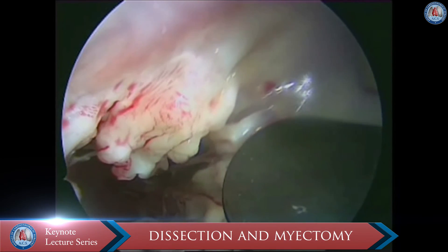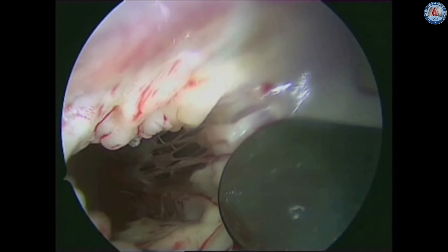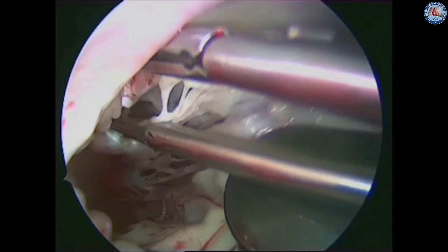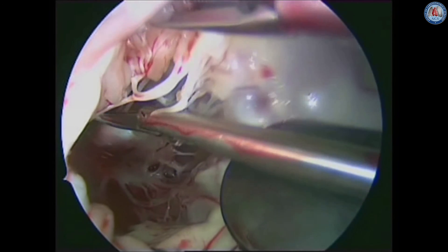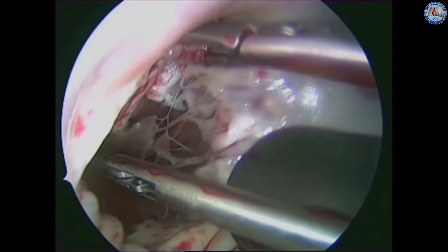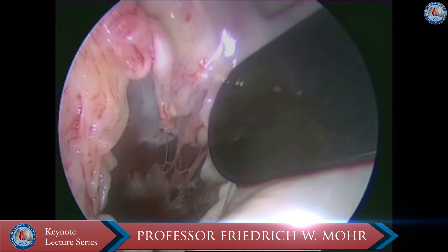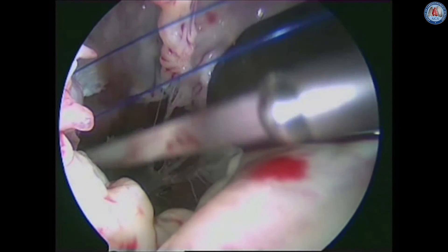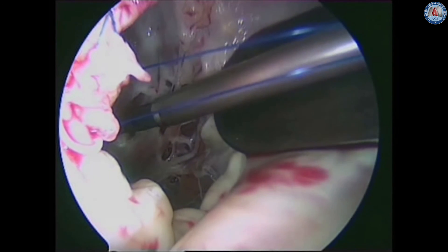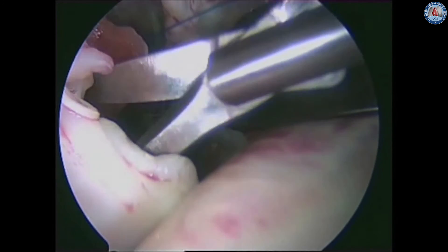This video shows a typical example where malalignment of the anterior leaflet was the cause of the severe hypertrophy, reflecting the case seen in the MRI. The video shows how all the chordae to the anterior leaflet are dissected, leaving only a free margin. After the anterior leaflet is flipped towards the septum, the myectomy deep into the ventricle is performed beginning at the aortic valve down deep into the ventricle, starting with an incision with a knife and completed with scissors.